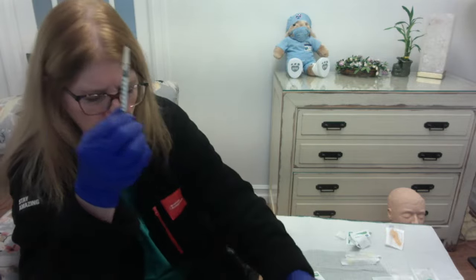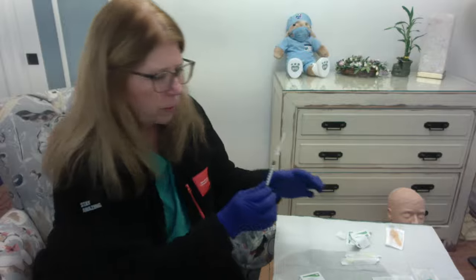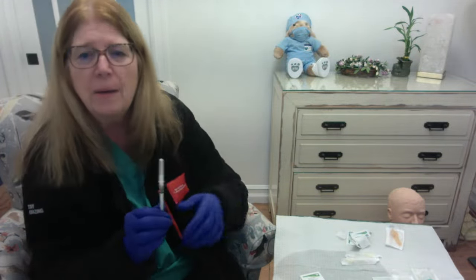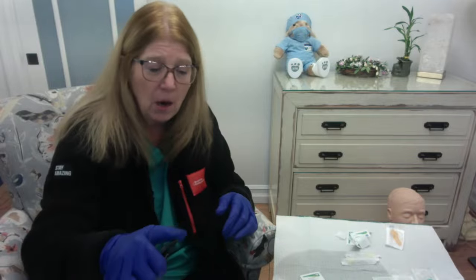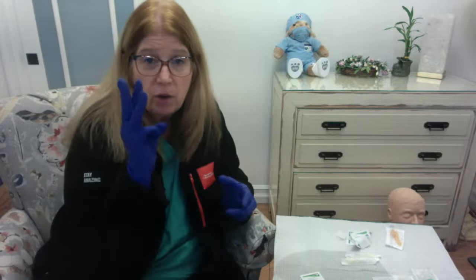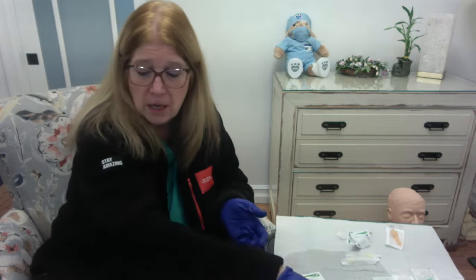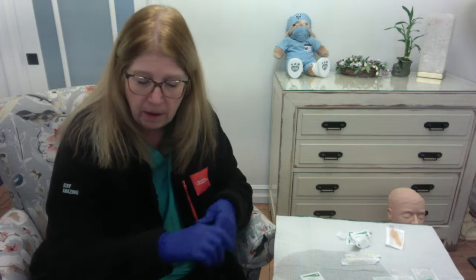Take my vial off. I'm going to safely recap, snap it down, okay? And then I get ready to go to my patient. So I go to my patient, I do hand hygiene. Of course, this is a medication, so I'm checking that medication 3 times before I give it. I'm following all of those 5 rights of medication administration. And then, of course, the 6th right will be the documentation.